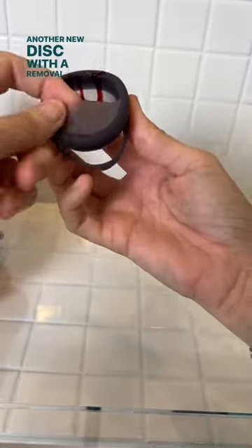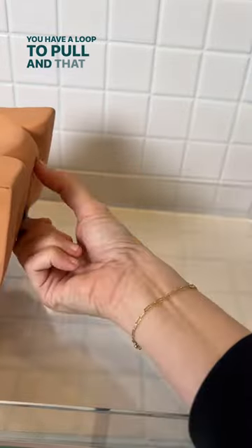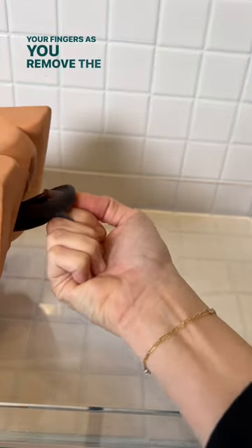Another new disc with a removal aid and a leak-proof shield is the DivaDisc. You have a loop to pull, and that barrier can also protect your fingers as you remove the disc.